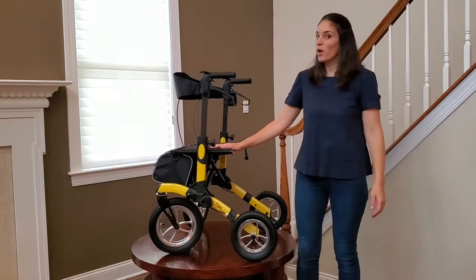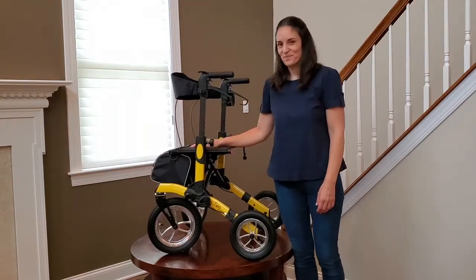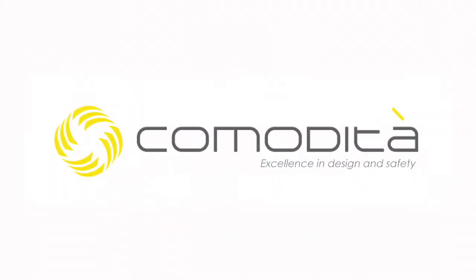And your Comodita Tipo All Terrain is ready to go.